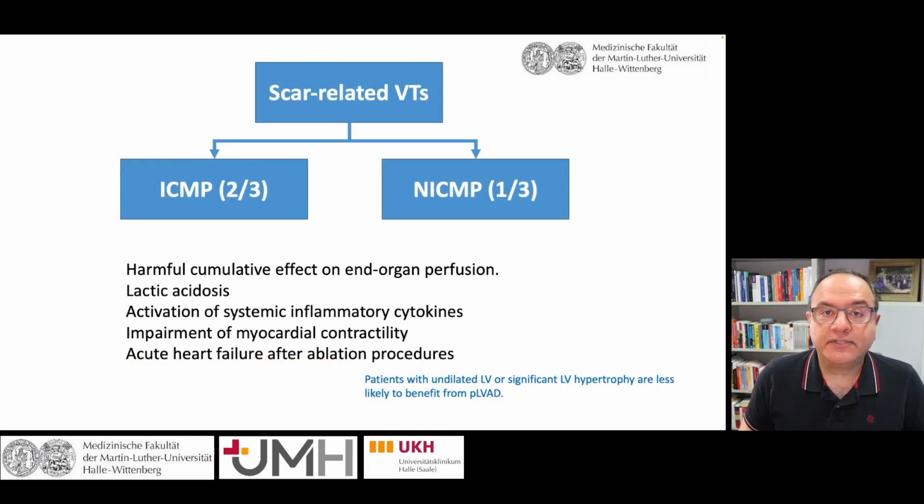Hemodynamic support is usually used during catheter ablation of scar-related VT. In 60% of the patients, we usually have scar-related VT in combination with infarction or ischemic heart disease. In 30 to 40%, and this is increasing, we have scar-related VT in patients with non-ischemic cardiomyopathy.